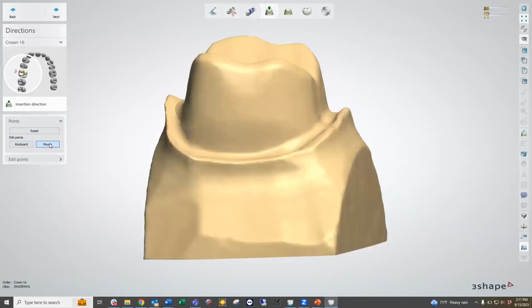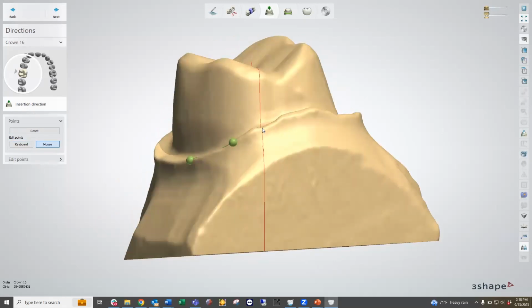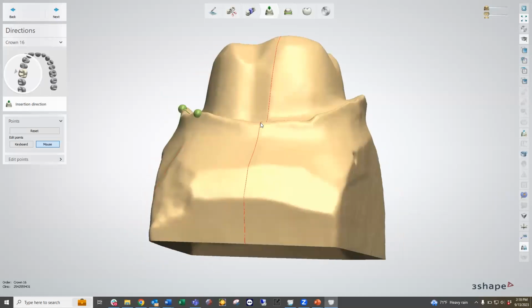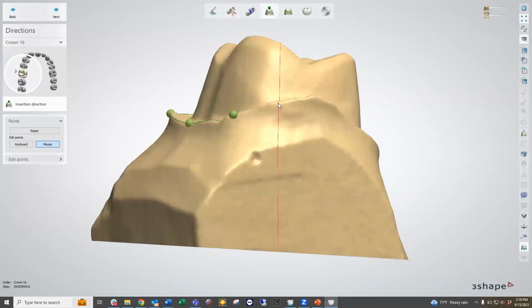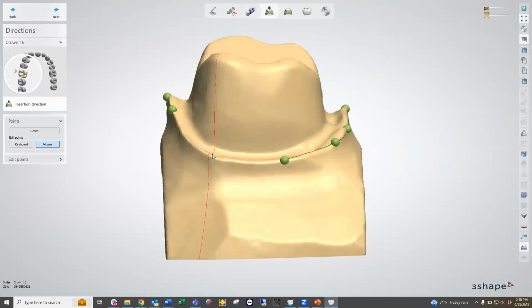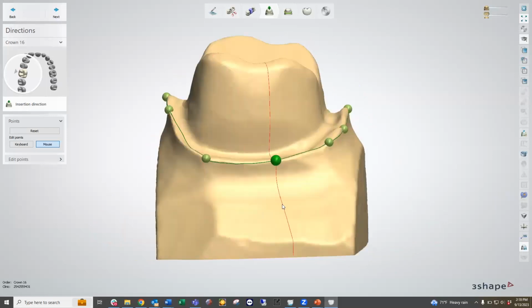Another option that we have is we can go ahead and place our own dots. Once we place that dot, we can see the height of contour with this highlighted line that we see here, and it automatically rotates the tooth around to allow us to select multiple dots. Now, this is not necessarily going to be something that we need to do. I'm just showing you as a point of fact because we do have an option to use this to facilitate our insertion direction.